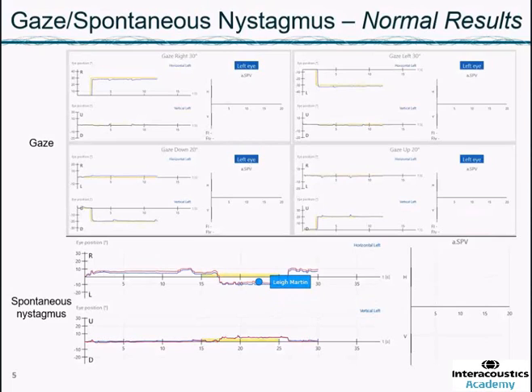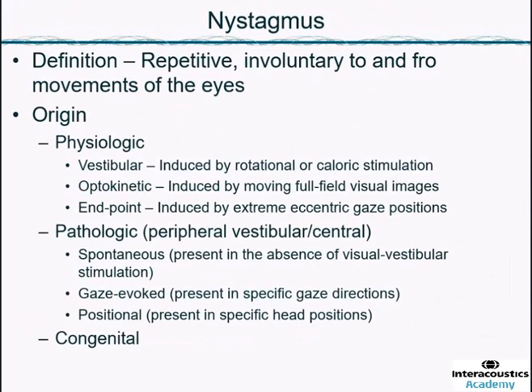Here you see the area that's in yellow. It's where the patient is given a target. Before that, the patient is in complete darkness. But again, this one, we'll talk about this in far more detail in the next webinar.